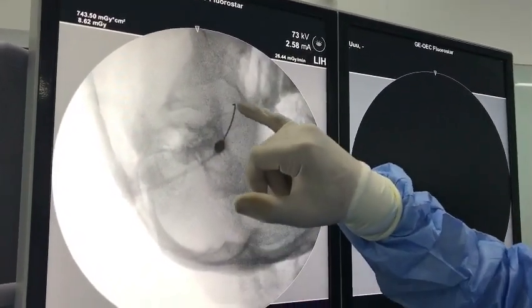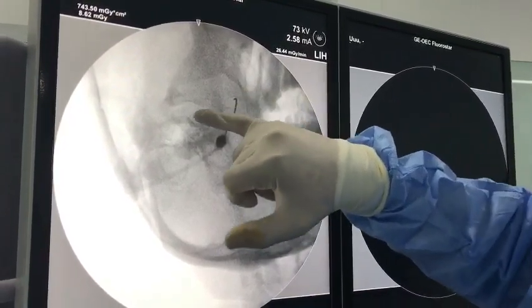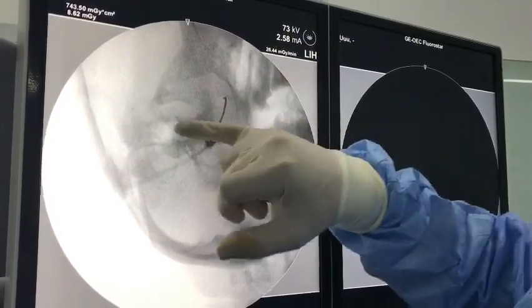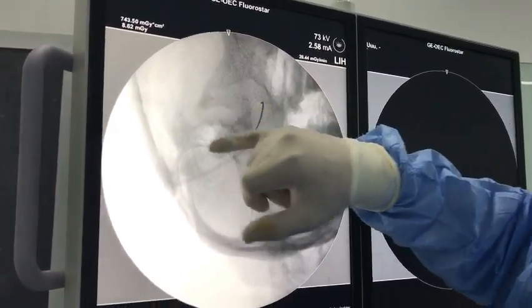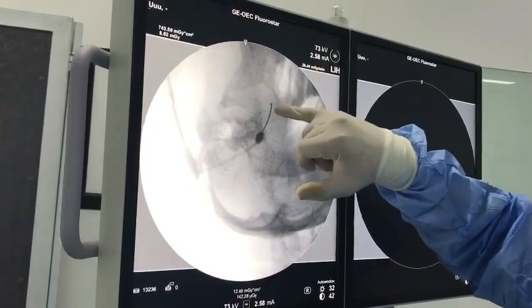Foramen ovale — see the needle inside. This is the foramen ovale and this is the angle of mandible. This is the mastoid process, and here the needle is inside the foramen ovale.